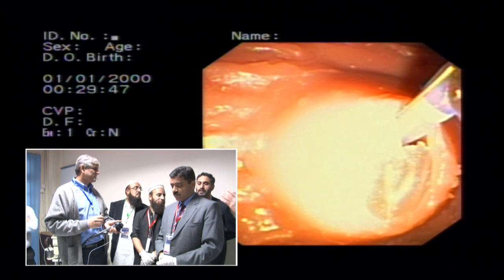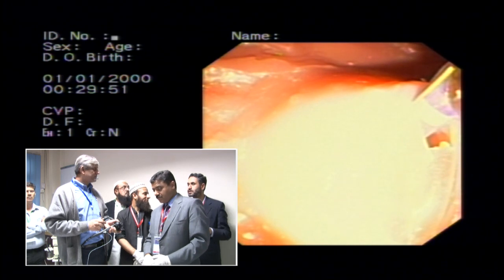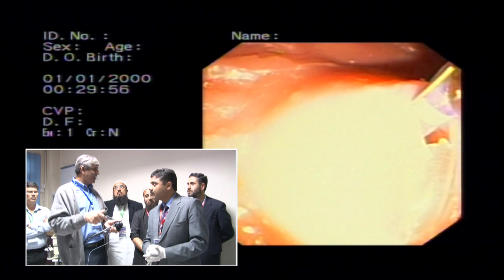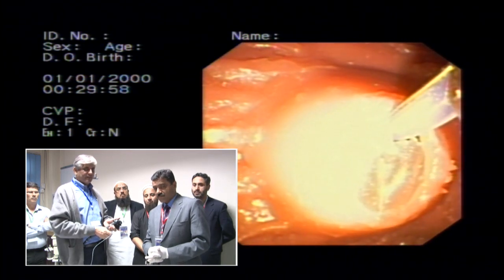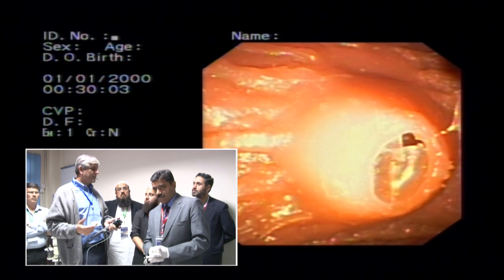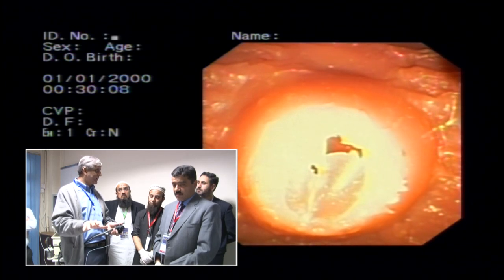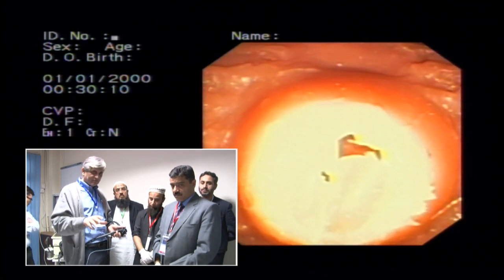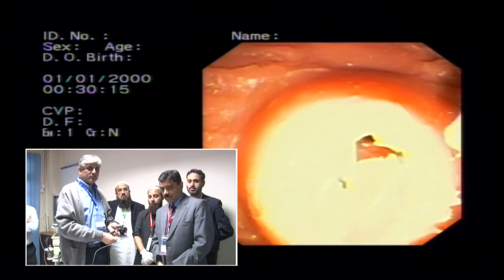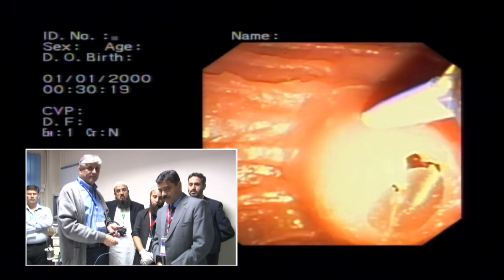The second problem is when this doesn't work. If I've tried this, now you're coming down to 2 out of 10, right? Then you come out and you see what it is that you're doing wrong. One of the problems is orientation. Fix your position again, have a look at the whole thing again. Take a little bit of wire out, and you realize you need to go here.